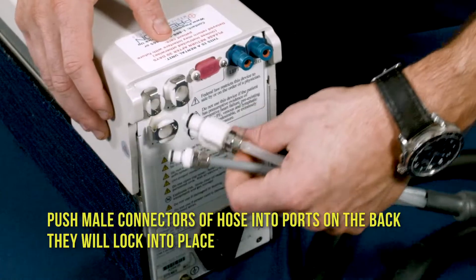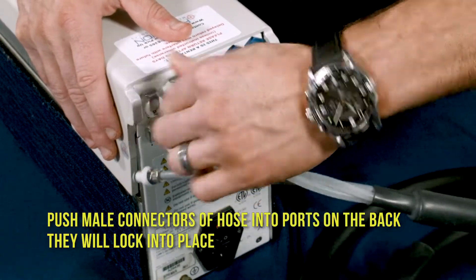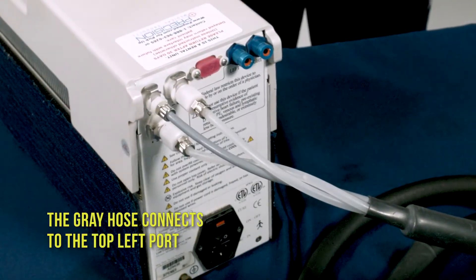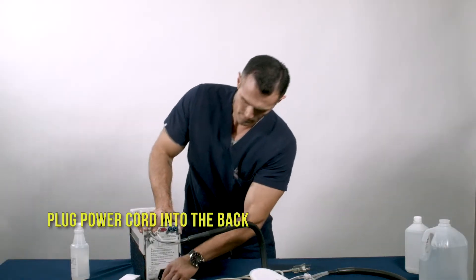Push the male connectors of the hose into the ports on the back — they will lock into place. The gray hose connects to the top left port. Plug the power cord into the back.